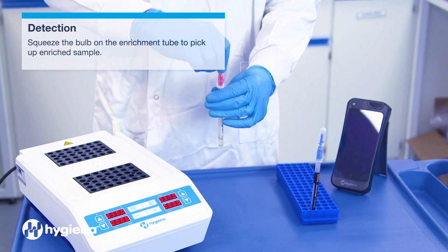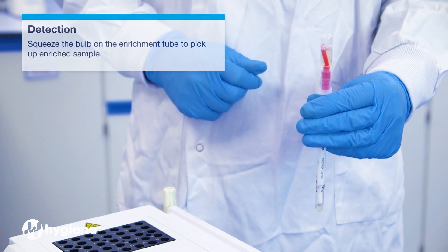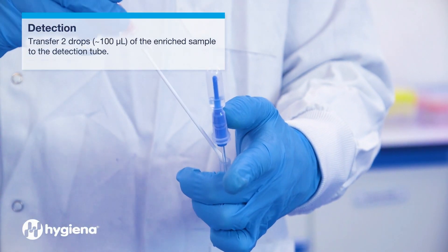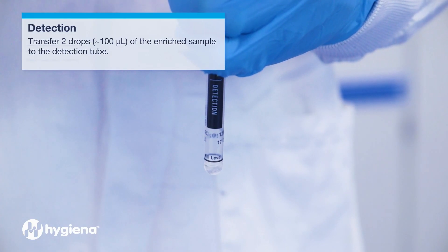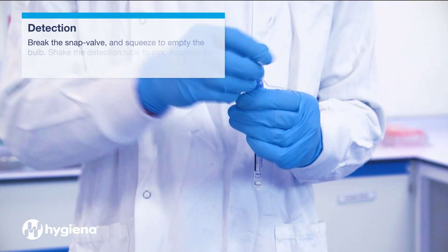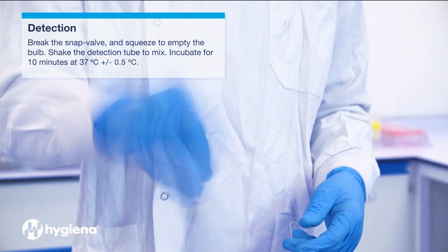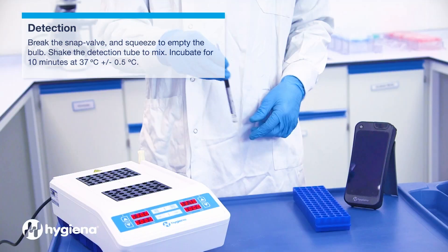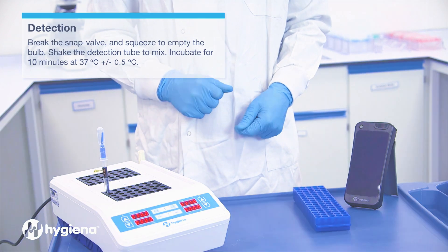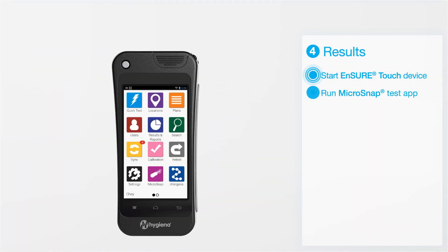Detection. Squeeze the bulb on the enrichment device to pick up the enriched sample. Use the built-in pipette to transfer 2 drops or 100 microliters of enriched sample to the detection device. Break the snap valve and squeeze to empty the bulb. Shake the detection device to mix, then incubate for 10 minutes at 37 degrees.